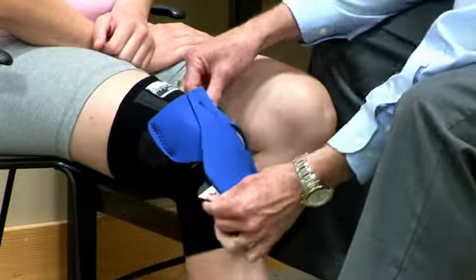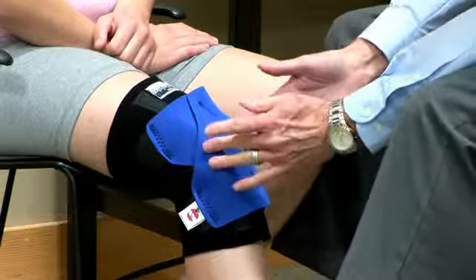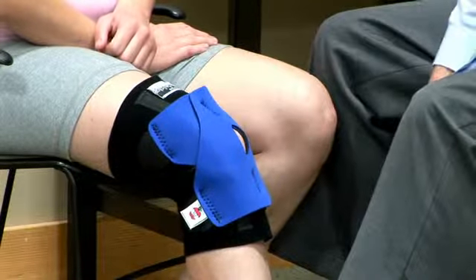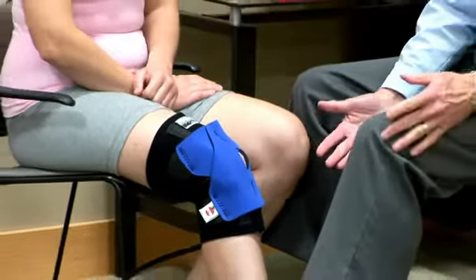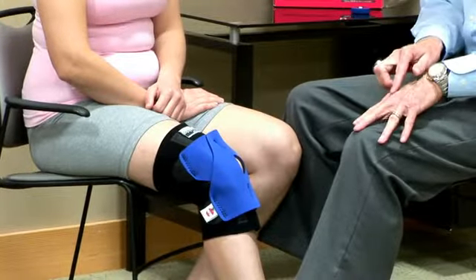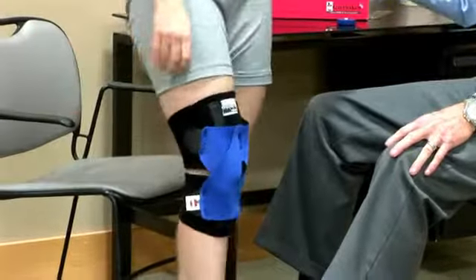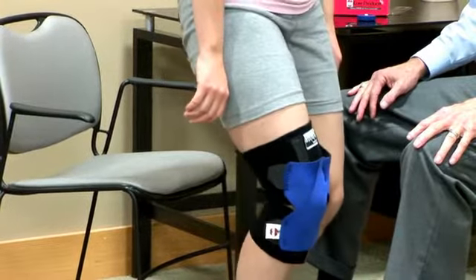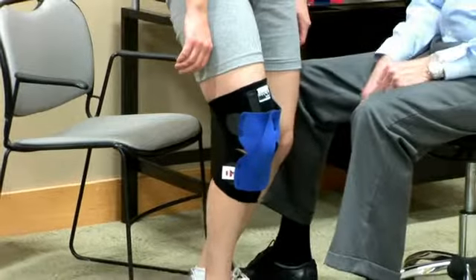We can adjust the position and tension here, fitting it to where it looks right. Then we ask the patient to stand and do a little baby squat so they can feel if the patella is in its groove. They can feel it better than we can see it.